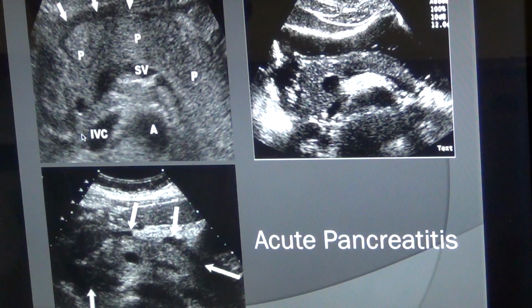So we have to measure the head. You're going to measure the head from here diagonally to this, then the neck from here to this, then the body from here to this, and the tail from here diagonally like this. If you are an experienced sonographer, without measurement you can say, okay, now I see the pancreas is very engorged, the pancreas is very enlarged.